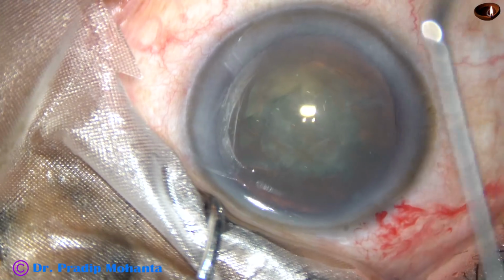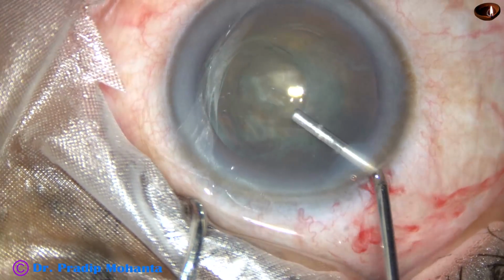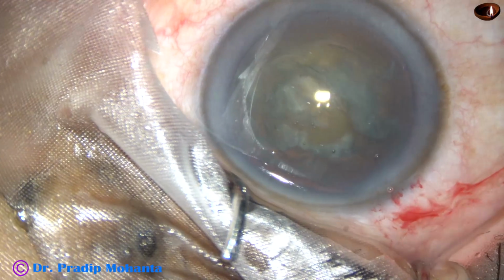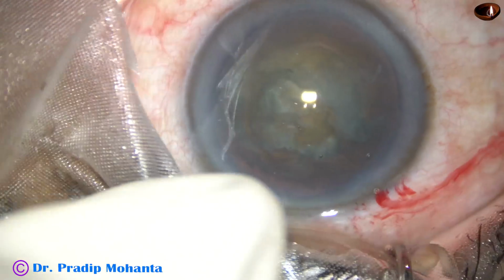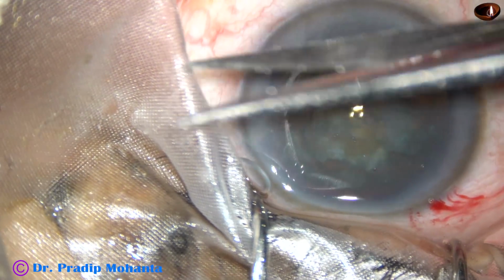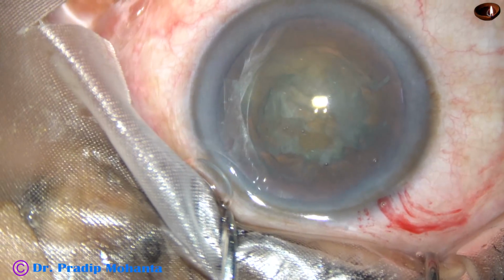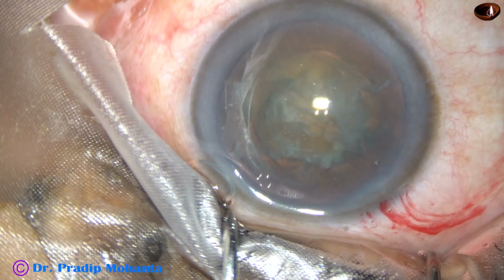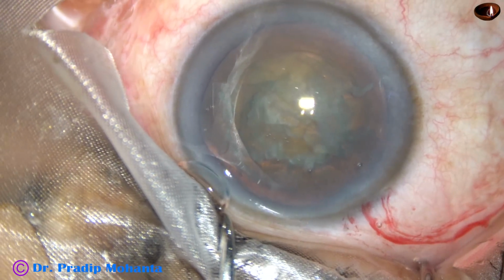Now 2% hydroxypropyl methyl cellulose is injected, and then the tip of the phaco handpiece is introduced into the anterior chamber. The machine being used is Oatley Catarix 3.